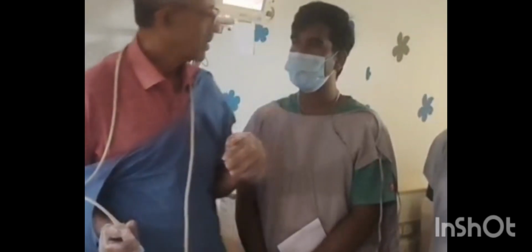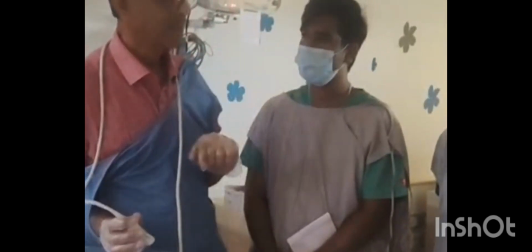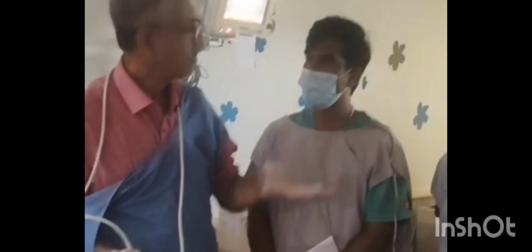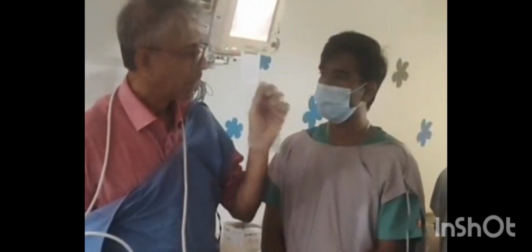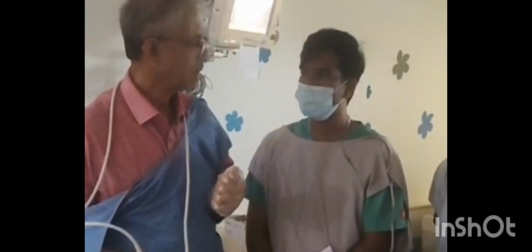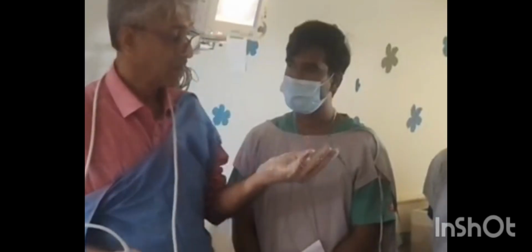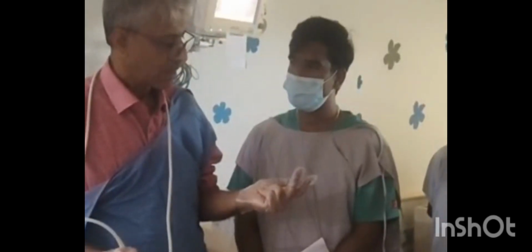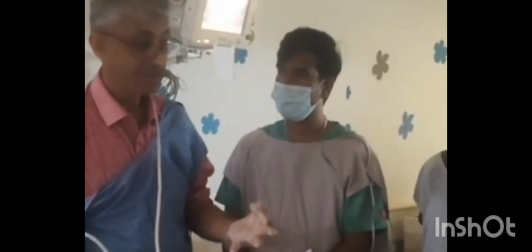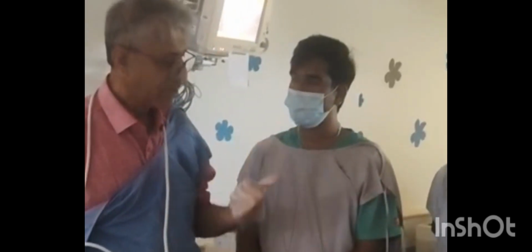In addition to that, as neonatologists, it is our duty to look at any other organs also affected. While doing that, we could find a bright shadow around the frontal horn of the lateral ventricle, extending to the parietal and occipital area. So now we have respiratory failure, cardiac dysfunction, and also involvement of the brain. So definitely it's an inflammatory syndrome.